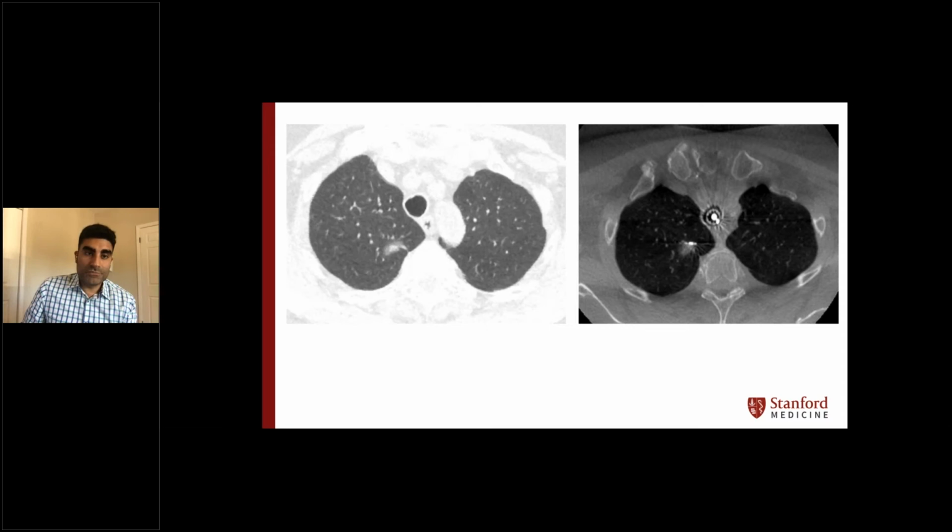Here's a really small ground glass lung nodule that you can see in the right upper lobe. You can see that my cryoprobe is located right on the edge there, and we were able to diagnose a well-differentiated adenocarcinoma. Once again, this is another target that would have been very challenging to get, but because I can confirm tool in lesion, I felt comfortable going after it and successfully getting the diagnosis.